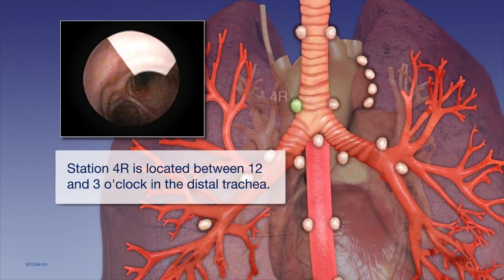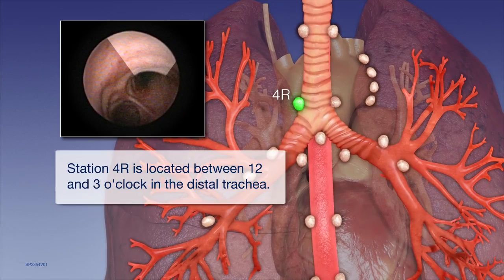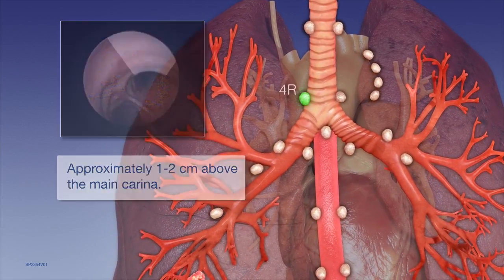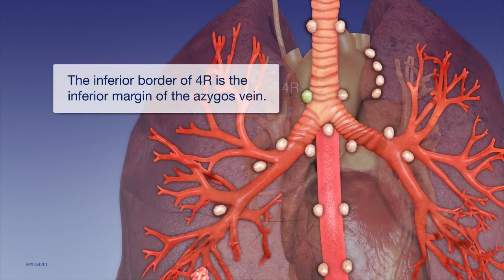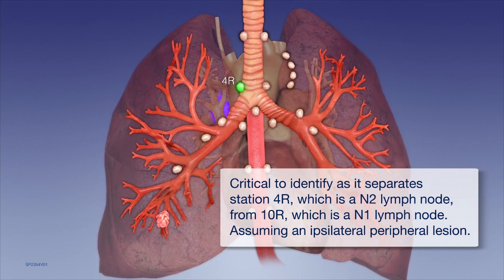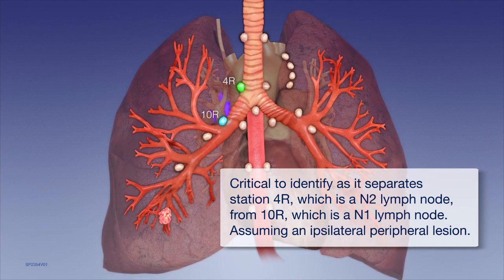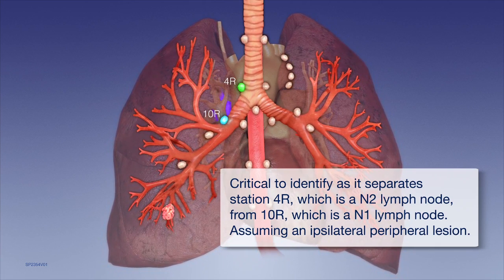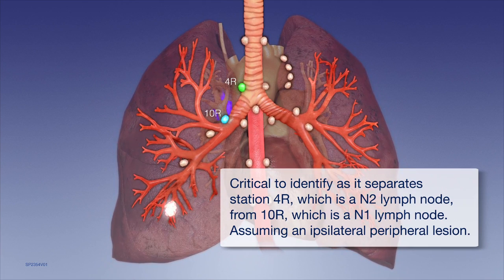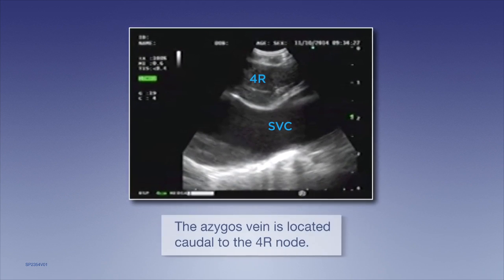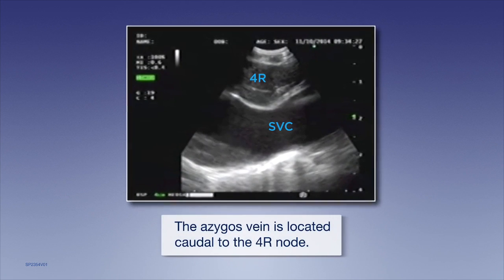Station 4R is located between 12 and 3 o'clock in the distal trachea, approximately 1 to 2 centimeters above the main carina. The inferior border of the 4R lymph node station is the azygous vein, which is critical to identify as this landmark separates Station 4R, which is an N2 lymph node, from Station 10R, which is an N1 lymph node, assuming an ipsilateral peripheral lesion. Here we identify the 4R lymph node with the superior vena cava anteriorly; the azygous vein is located caudal to the 4R node.